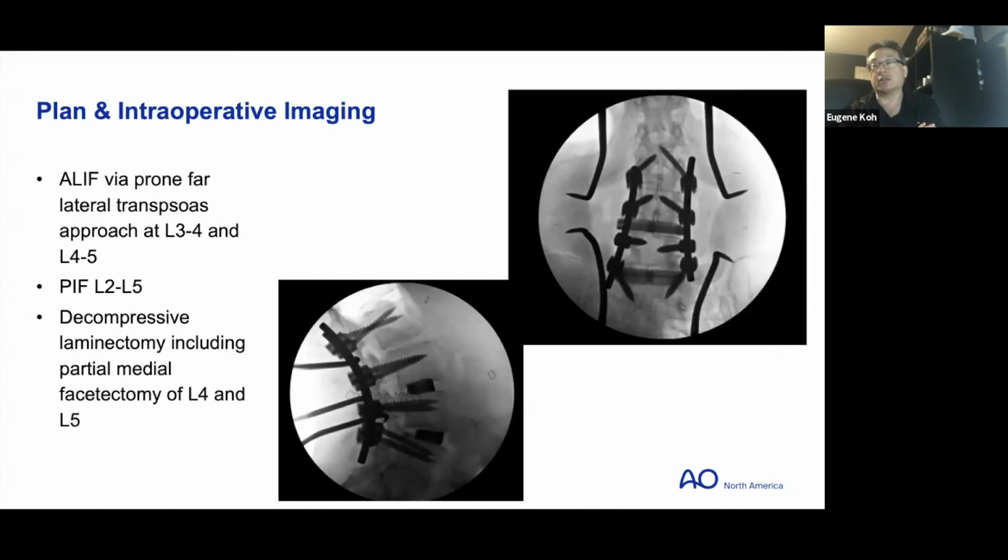Usually, if it's just a lateral, when I've done these on a lateral and then backed them up posteriorly, it's about a 30-minute turnaround time, undraping and repositioning the patient. So this is much faster doing it prone. Someone, the fellow, can close up the incision as I'm exposing posteriorly.